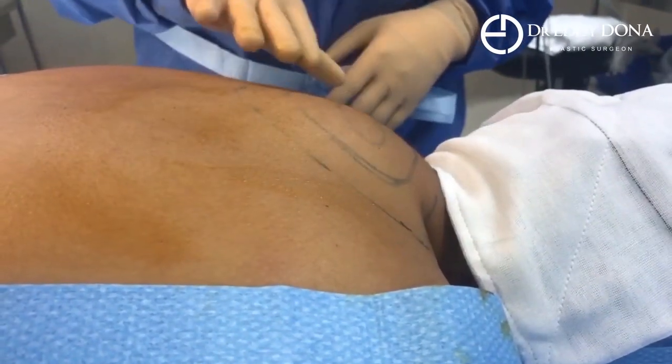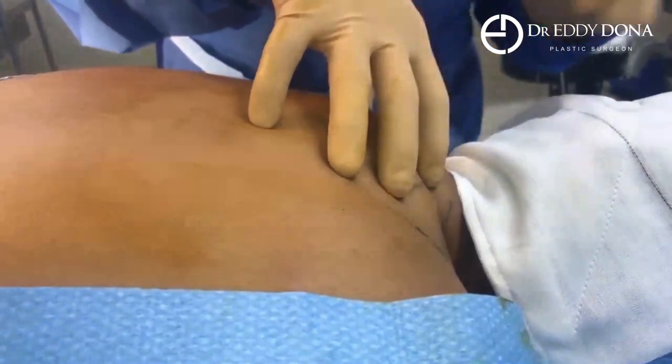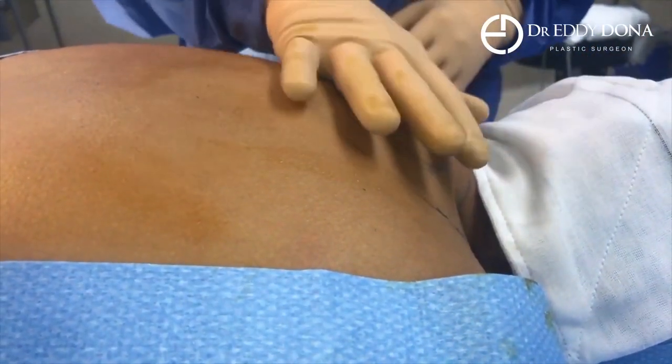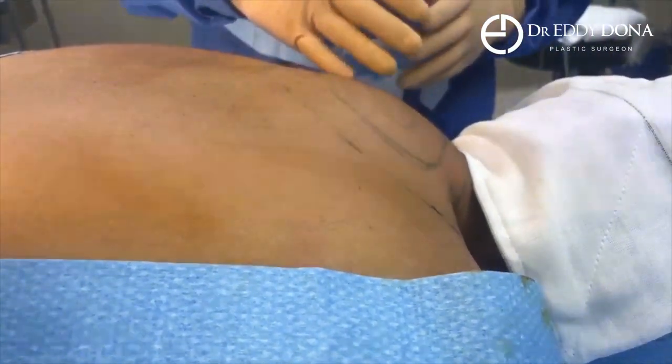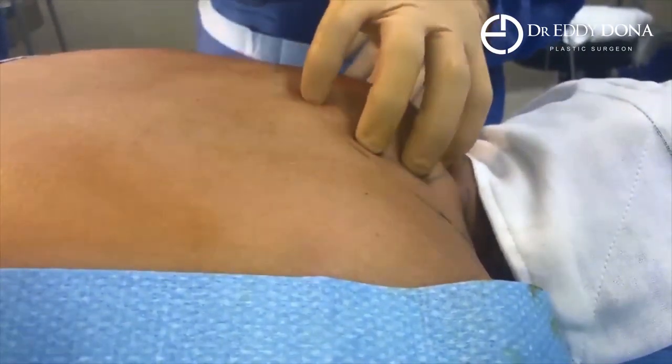This girl has a condition called Buffalo Hump, which refers to abnormal fat deposition in the back of the neck. There's the head, the back, and this is the back of her neck. It can occur for a number of reasons — just due to weight, a number of hormonal conditions can cause it, and also a number of medications can cause it — but the end result is too much fat in the wrong spot.